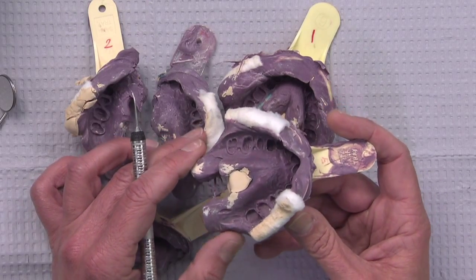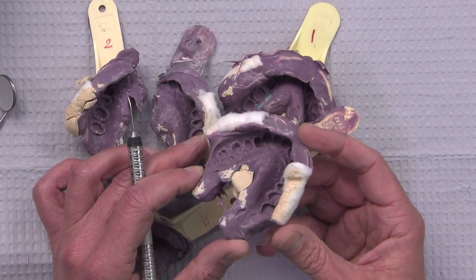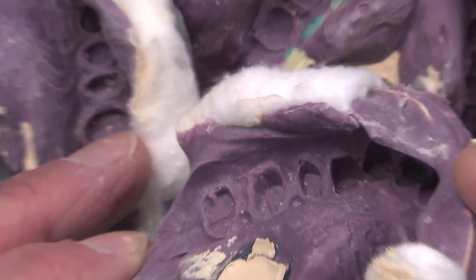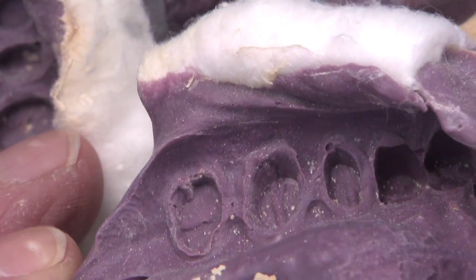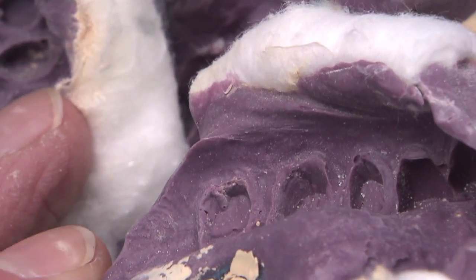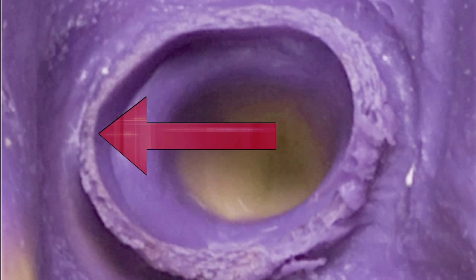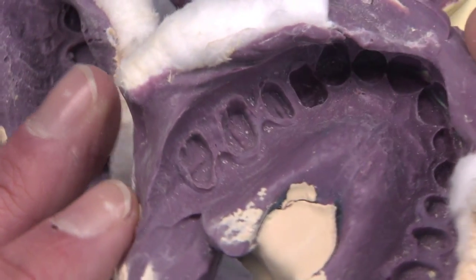But I noticed that there really doesn't seem to be a lot of retraction going on. As we zoom in a little bit and look at some of these margins of these impressions up close, hopefully, I know I do at my lectures, I really try to have dentists drill into their mind what an ideal impression will look like. In fact, we'll throw up a picture of one right here so you can see what an ideal impression looks like. It's got a fin of material beyond the margin. We have to be able to see some material beyond the margin, and if the end of the impression is right at the margin, that is not going to be adequate. And so when I look at this, I notice that.